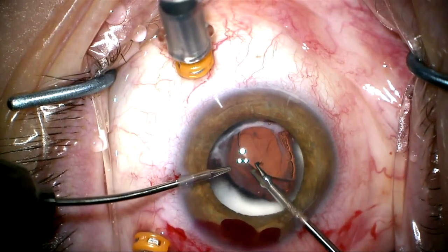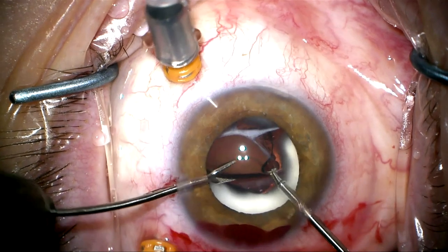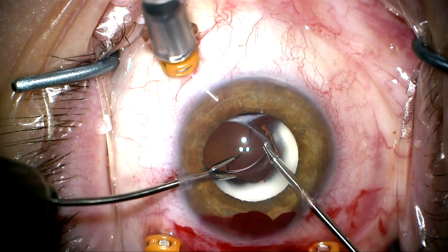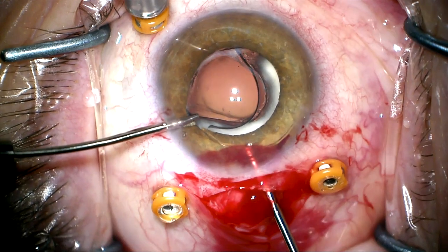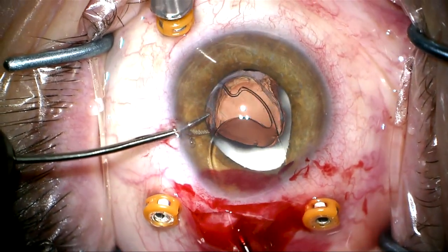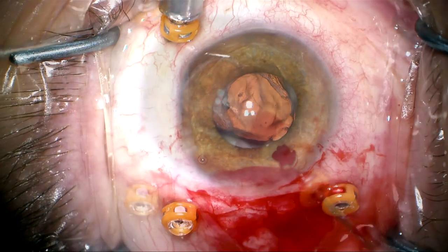I'm now going to grasp the optic of this PMMA lens and try to rotate this haptic up anterior to the capsular rim into the anterior chamber. I'm now going to get this haptic out the main incision and grab the optic and extricate the lens in one piece.